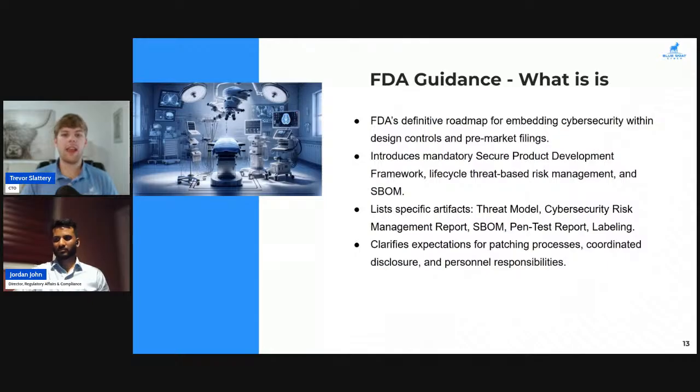We're looking at a risk-based approach to handling risk management. So scaling levels of risk depending on scaling levels of device complexity and involvement, talking about generating that SBOM, maintaining that SBOM, what we're doing as far as our testing procedures. And the FDA guidance also talks about all of the accompanying standards that are important for a specific procedure or a specific process. This is where we see references to NIST 800-115.